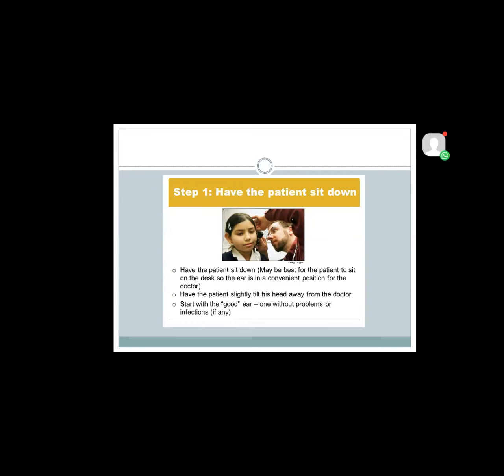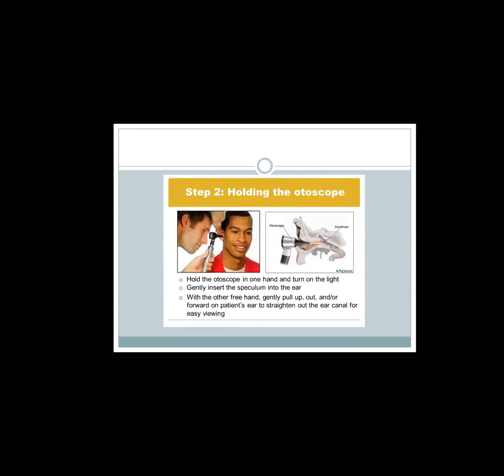Now, because we are dealing with ear examination, we nowadays use an otoscope. So this is another instrument, the otoscope. It's a battery operated one, and we use it for examination of the ear.